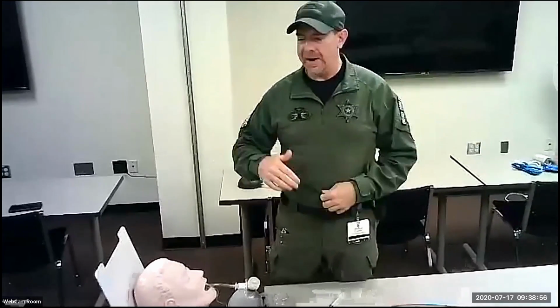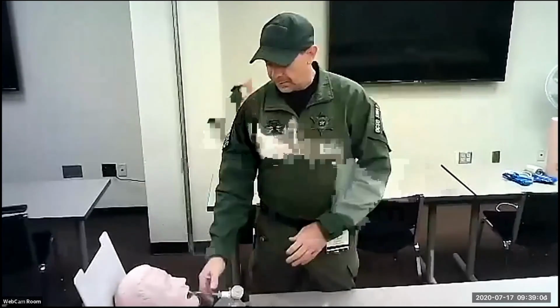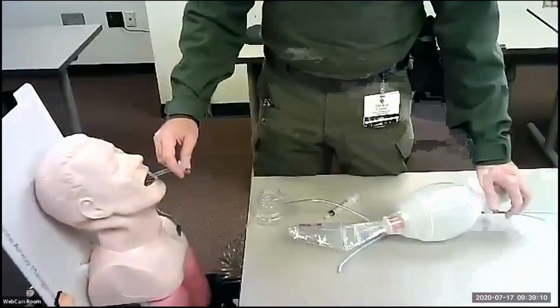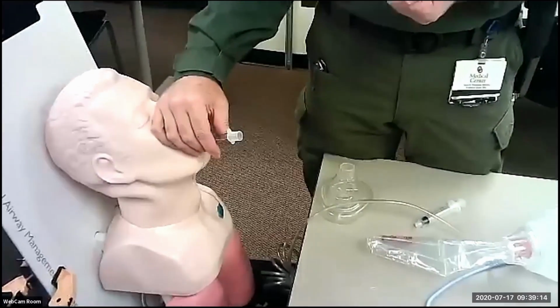So if you think about this, we exhale carbon dioxide. It only comes from our lungs, right? Not our stomach. We may get a little bit from our stomach if we just drank a Diet Coke because of the carbonation, but you don't get actual waveforms. We've got caps that go on the end of this. It'll change colors every time they exhale. Yellow, yes. If it turns yellow or gold, it's yes, you're in the right place. That means it's actually sensing carbon dioxide. It's got to be in the lungs.